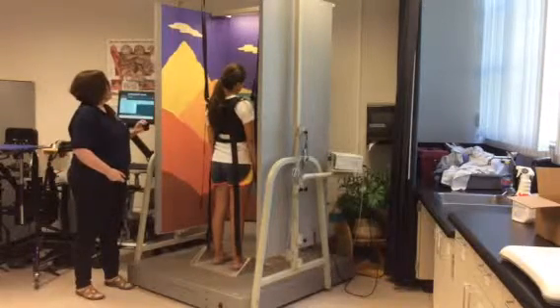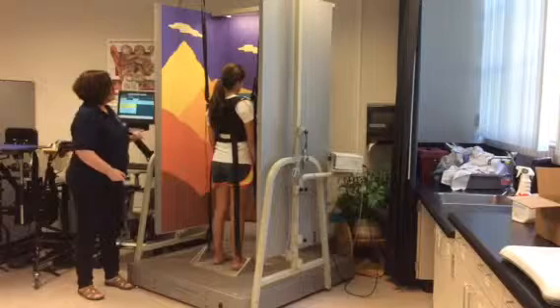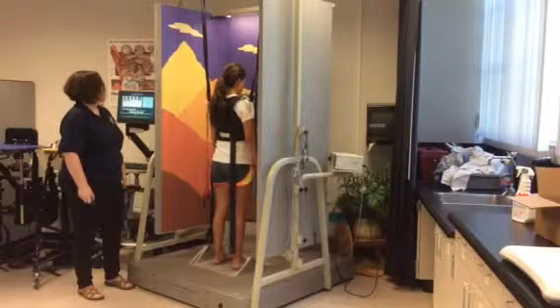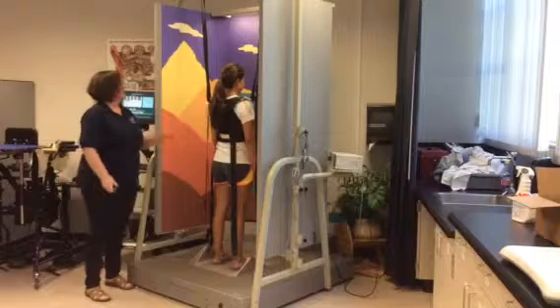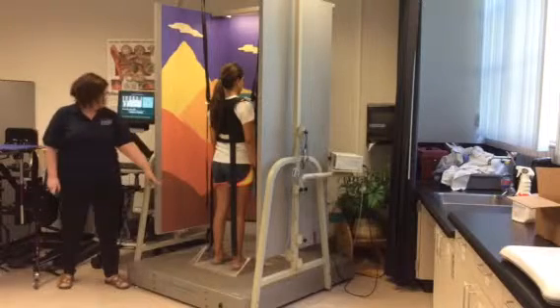So now we're going to look at the motor, and we're going to look at automatic and adaptive. All right. So what's going to happen is she's in the same position, backwards until I tell her, and then she fixed it. Did you see that? Did anybody see that? Watch again.